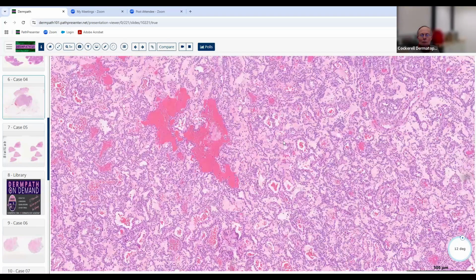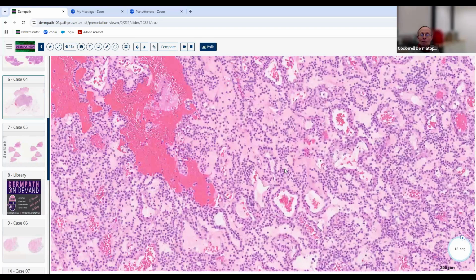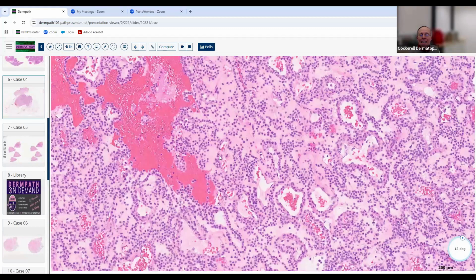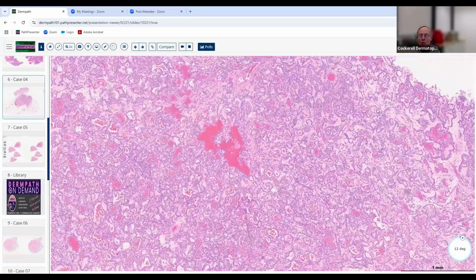That's almost comprised just of a mass of the glomus cells, and you have to look carefully to see residual blood vessels there, because the glomus cells have replaced most of the blood vessels. So that's really primarily a tumor of the glomus cells with just a few residual blood vessels, almost kind of like a schwannoma, where you can see the spindle cell component of the schwannoma and a residual nerve twig to the side that the schwannoma came off from. Well, a solitary glomus tumor is kind of analogous to that. You see a few little residual blood vessels, and then you see the solid massive glomus cells that are associated with that. But this one is a glomangioma, which is more of an angioma that's got the glomus cells associated with it.